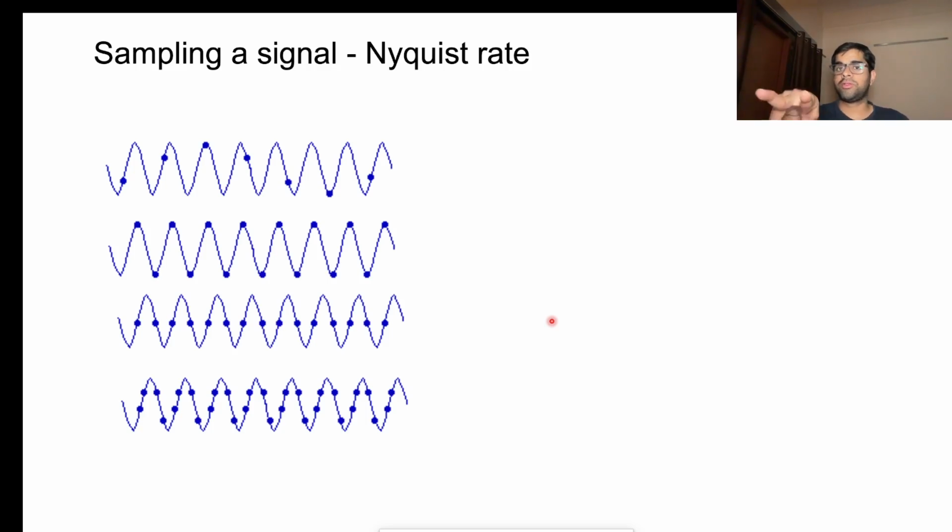Let's say a 1 kilohertz signal also has 80 hertz components, which are lower. You're sampling at a very high rate, so if the signal has 80 hertz, 10 hertz components, up until 1 kilohertz, and you sample at more than 1 kilohertz, you're also above the Nyquist rate for the signals of low frequency.